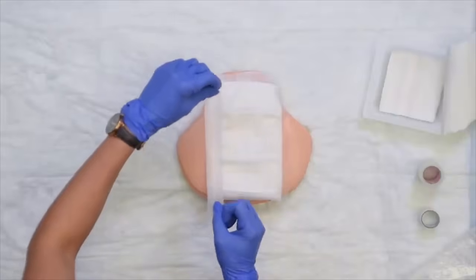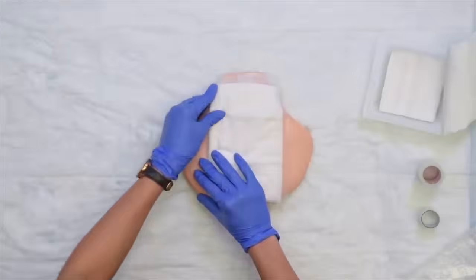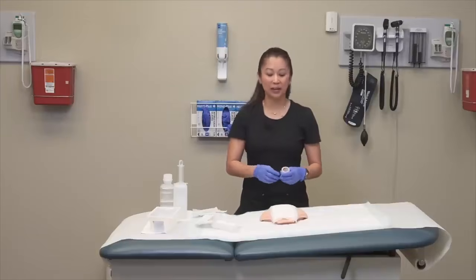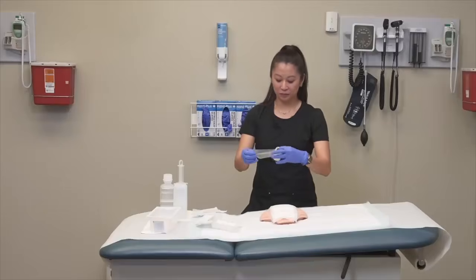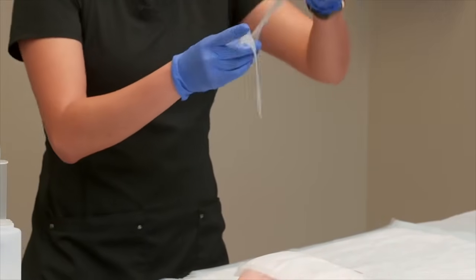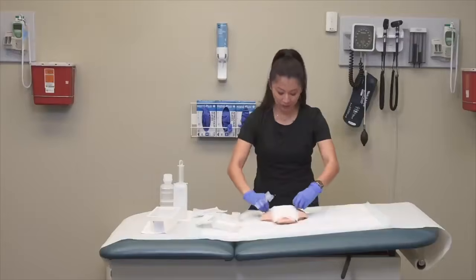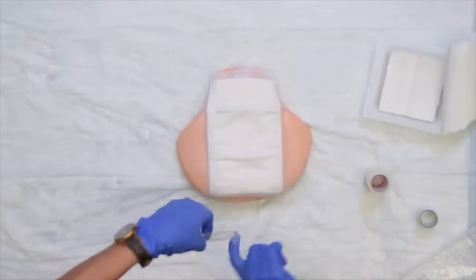As you see when I'm doing the window, I'm just tearing pieces and going to each side to enclose that. Now clearly this is kind of an odd shaped wound. You would have much more body surface to do on a patient, but the whole point is to make a window with the dressing in the middle. Minimizing the amount of tape on the patient's skin while also securing it down is ideal. You can imagine how much tape can get on a patient's skin when we keep having to change the dressing.